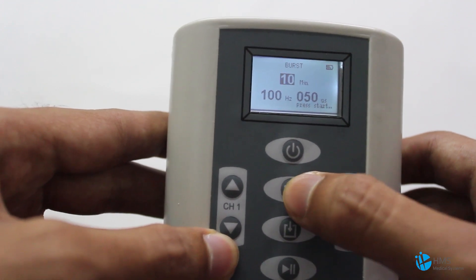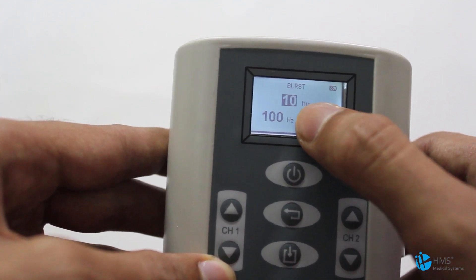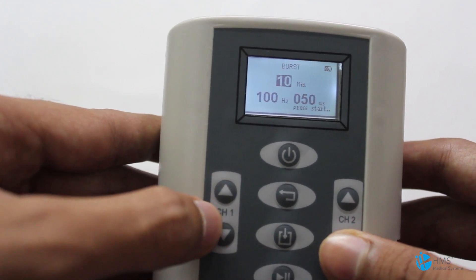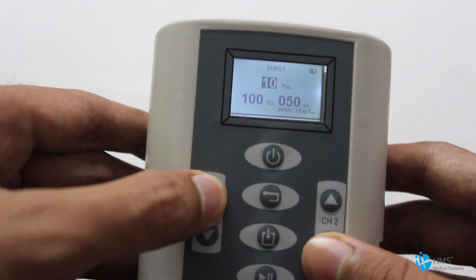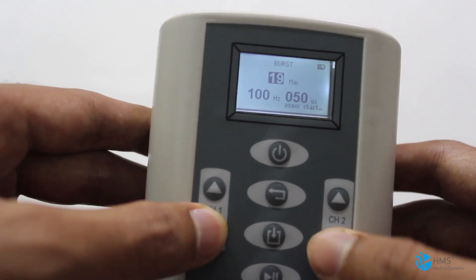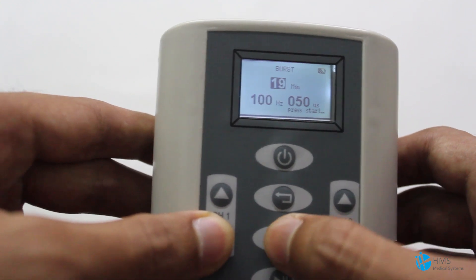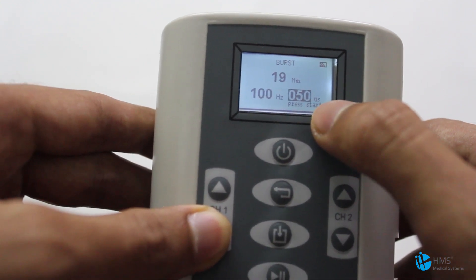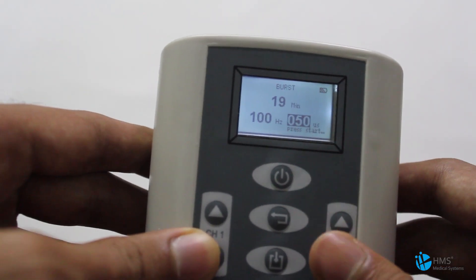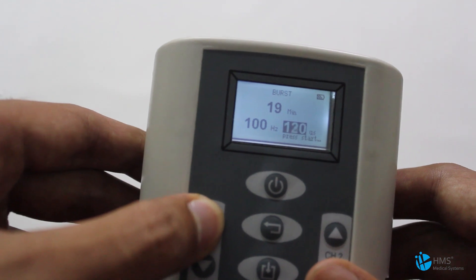This is the Back button. Now we'll get into Burst Mode. This one is the timer, which can be changed with the navigation buttons from Channel 1 and the intensity controller. You can set a maximum of 99 minutes. Press the Select button to get to the pulse width selection, where you can set up to a maximum of 300 microseconds for the pulse width.